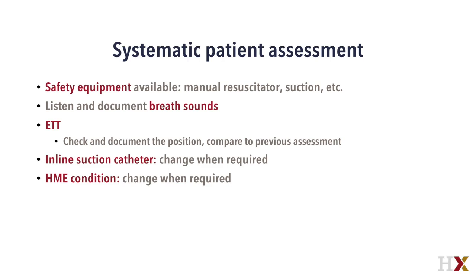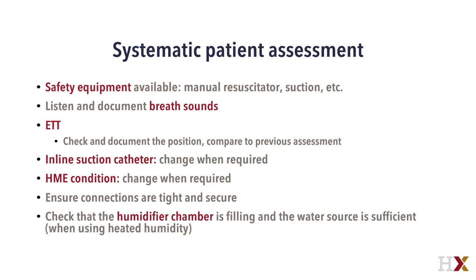Depending on hospital policy, this may be up to a few days. Ensure connections are tight and secure. Check that the humidifier chamber, if being used, is filling and that the water source is sufficient.